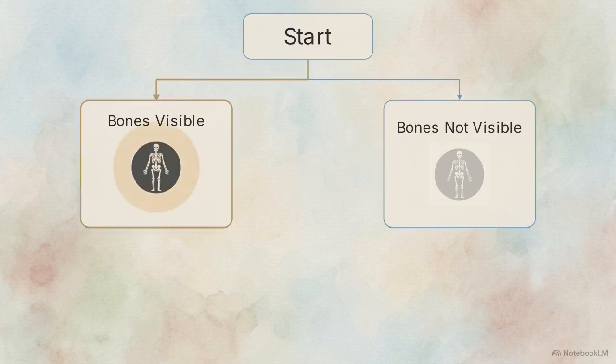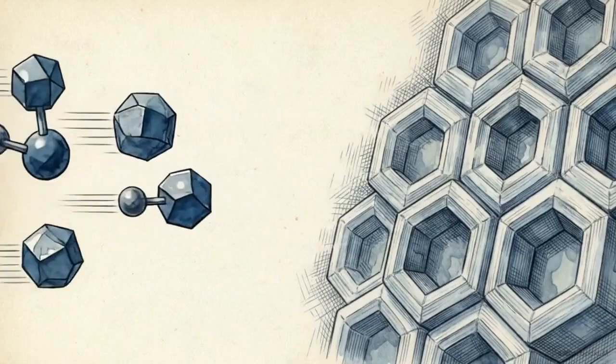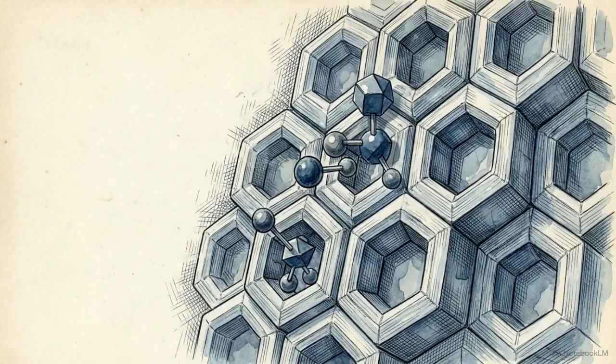Intense, clearly delineated skeletal uptake points definitively down the pathway to a technetium-99m MDP scan. To understand why the skeleton isolates this tracer, we look at the micromechanism known as chemisorption. A phosphate analog bypasses typical cellular entry entirely. Instead, it physically fuses directly into the hydroxyapatite matrix on the exterior surface of the bone.